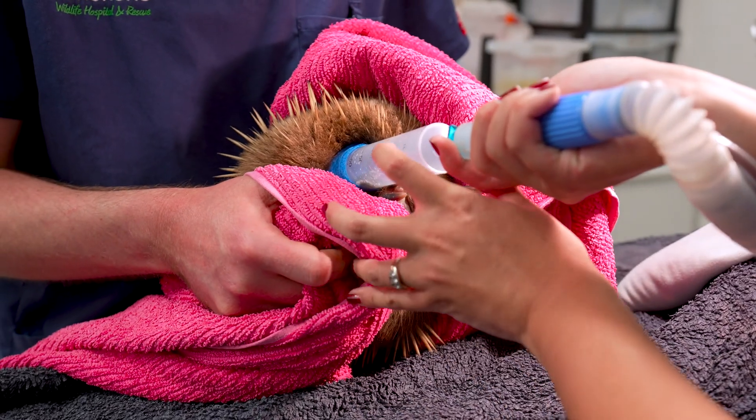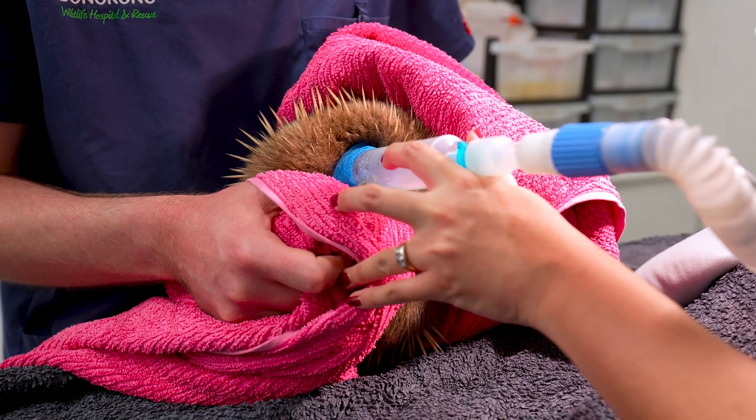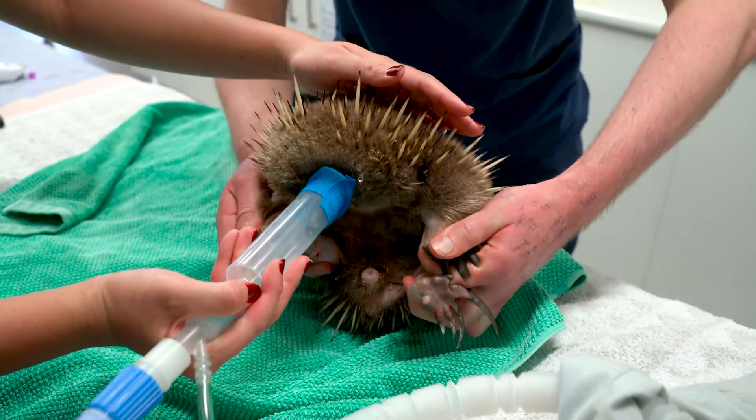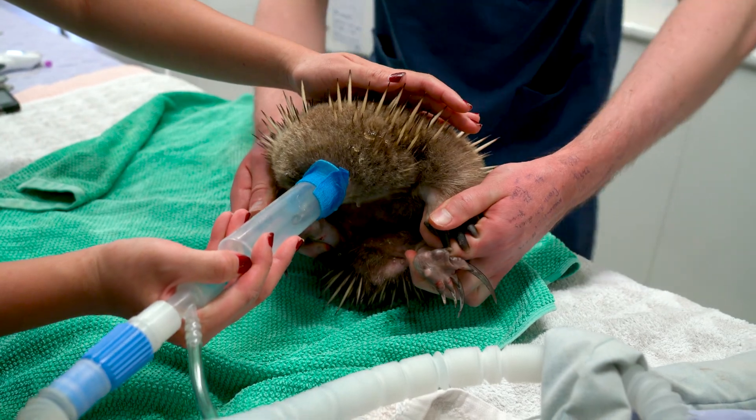The other thing to be aware of is that when they're stressed and in this position, they quite often can urinate or defecate, and that can be quite projectile when they do that.